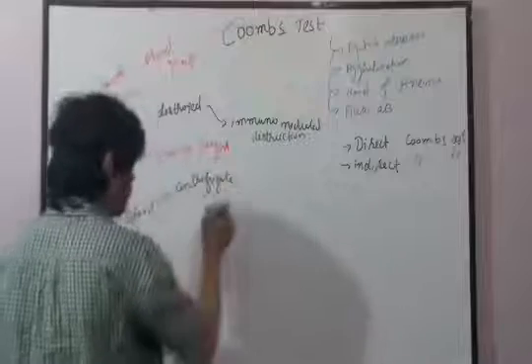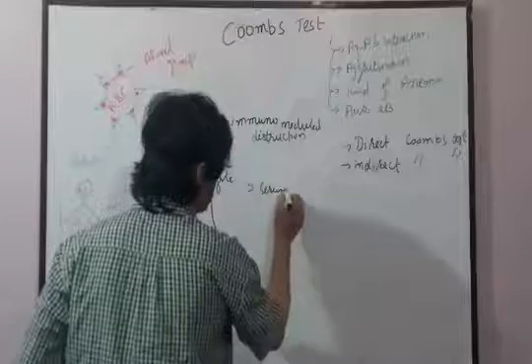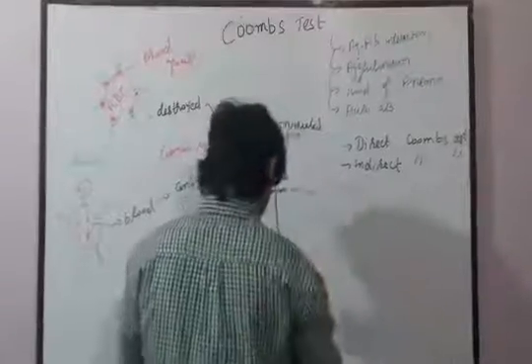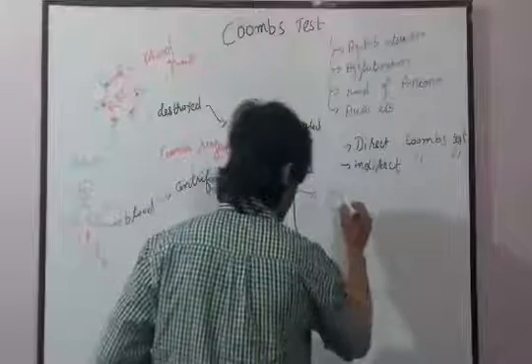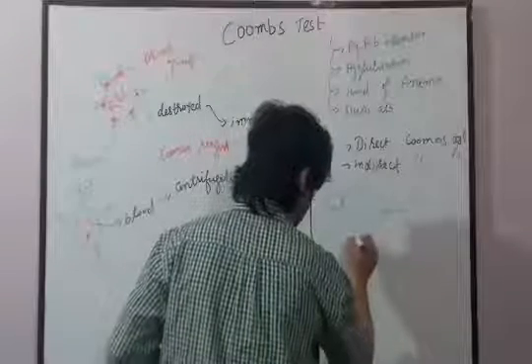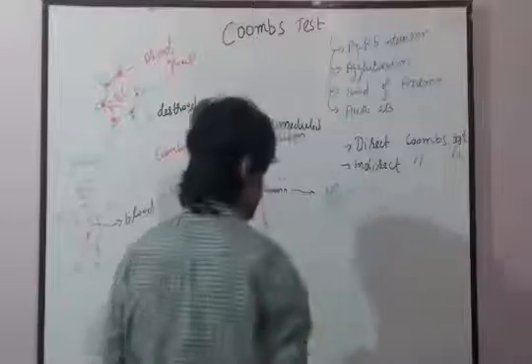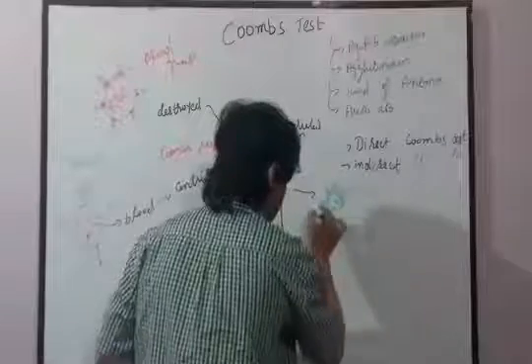After the centrifugation, we separate the serum. Once we get the serum, we load this serum into an animal. Let me draw with a green marker. Let's suppose this is an animal, any kind of animal, you can say a cat. Although my drawing is not good, I will still try my best to clear your concept.